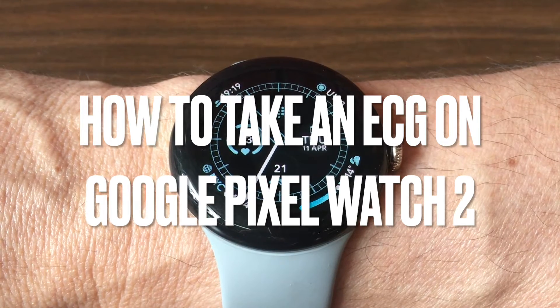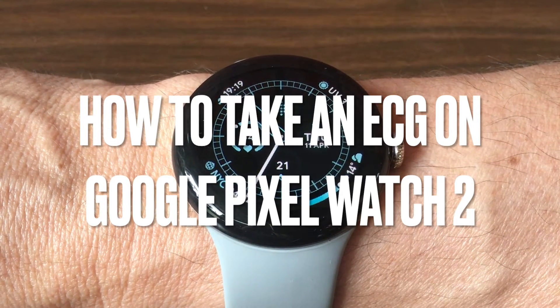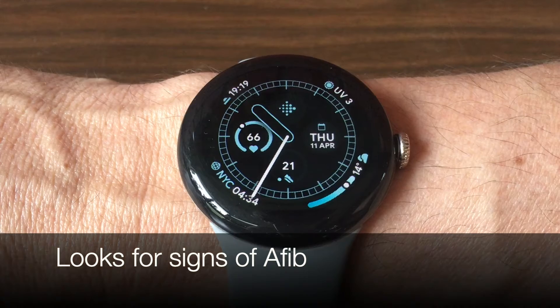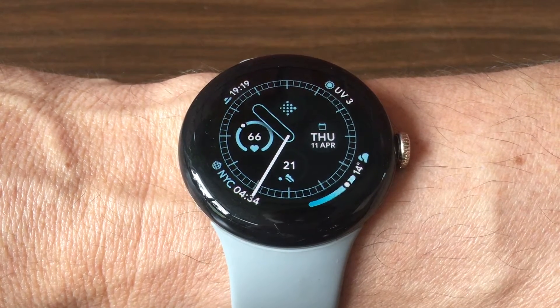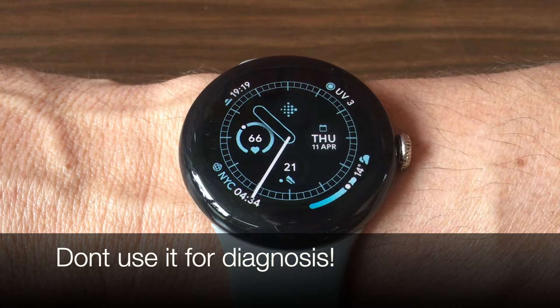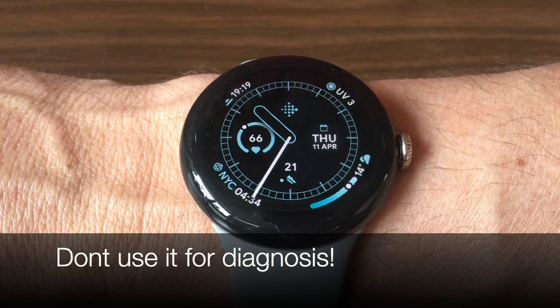If you have a Google Pixel Watch 2, you'll be happy to know that the device is capable of taking your ECG — it can look for signs of atrial fibrillation. It's important that you know how to use the feature. Of course, this shouldn't be used for diagnosis, but it could be useful to give you an indication that something might be wrong, which should hopefully prompt you to take additional measurements with proper medical equipment.